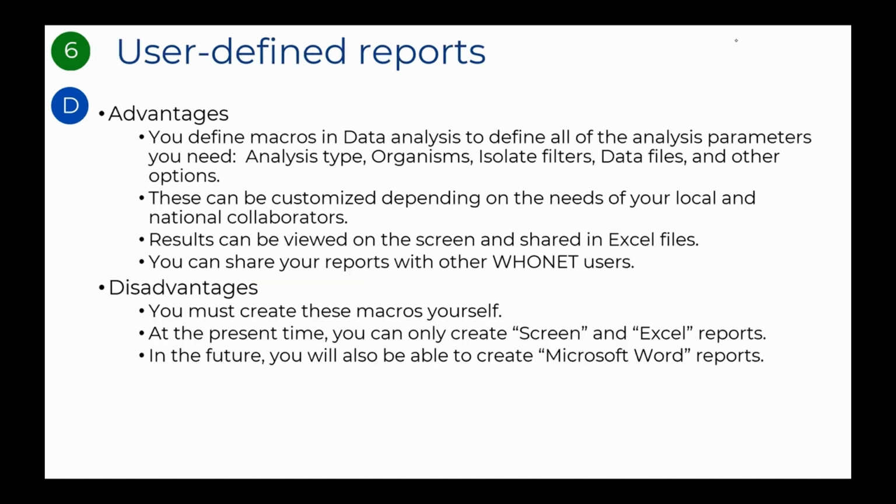User-defined reports offer a number of advantages over the WHONET Standard Reports. Most importantly, you can define your own macros with the organisms, filters, and options that you need, and these can be customized depending on the priorities of your local and national collaborators. You can send the analysis results to the screen or to Excel files that can be shared with your colleagues, and you can share the macro and report files with other WHONET users.